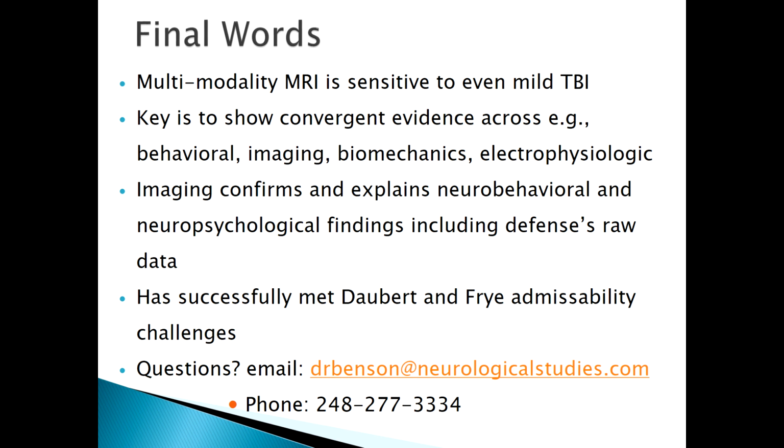So the question is, can it pick up mild TBI? There's no reference to whether you're referring to SWI or DTI, but I can answer both because we are looking at exactly that. What we find is that people with persistent cognitive or behavioral deficits most often do show abnormalities on DTI.